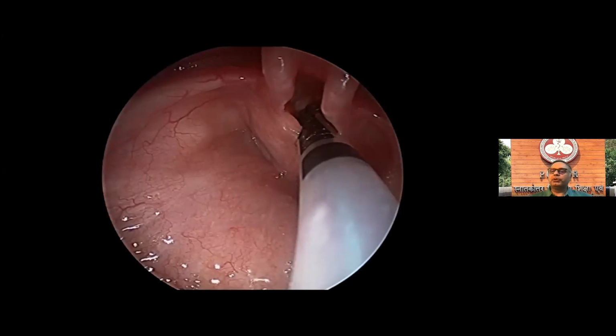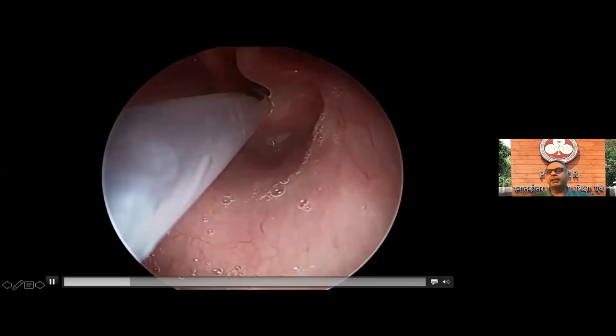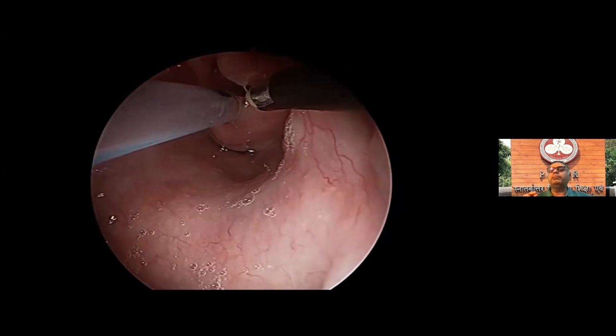So this is a picture of a preoperative case of laryngomalacia. You can see the omega-shaped epiglottis and it is falling back towards the posterior pharyngeal wall. So this case was taken up for supraglottoplasty with a coblation. So same thing, Miller's blade, the endoscope is threaded through the Miller's blade. You can see the short AE folds, the omega-shaped epiglottis. After the anesthesia team has intubated the patient, we take in a wand. Again, I'm using a microlaryngeal wand with a single electrode because I want minimal damage.